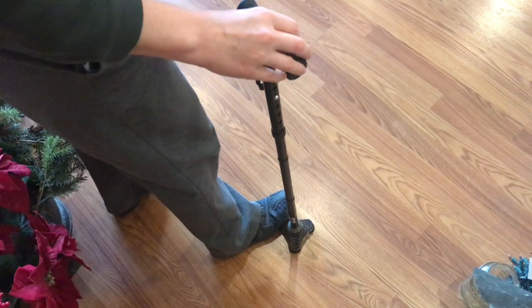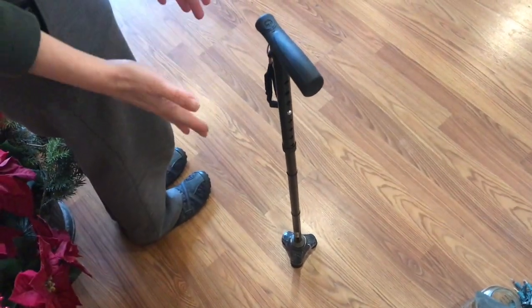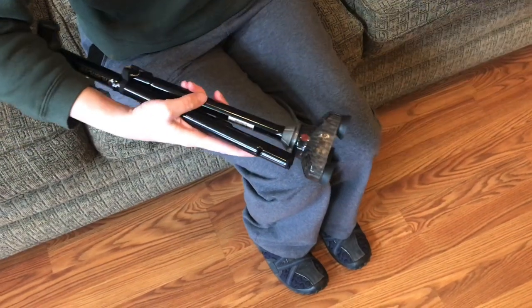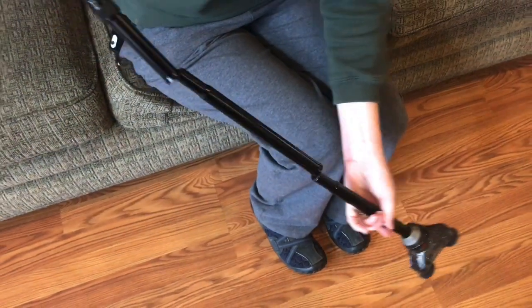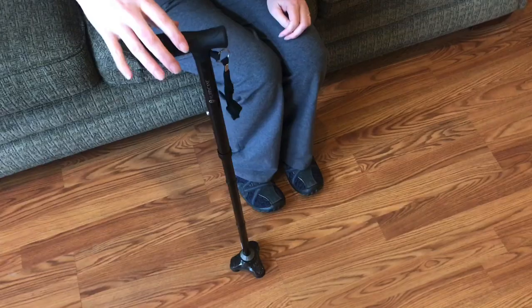This is the Hurry Cane. We found it at Ollie's for twenty dollars, and it was a really good deal for a very handy cane with a flashlight built in.